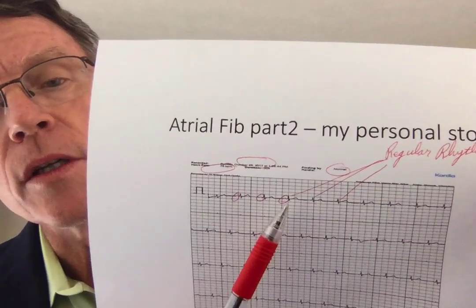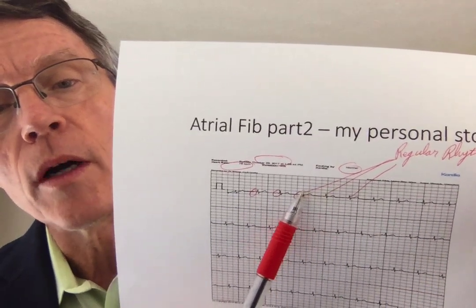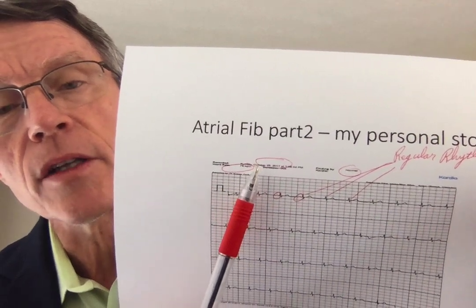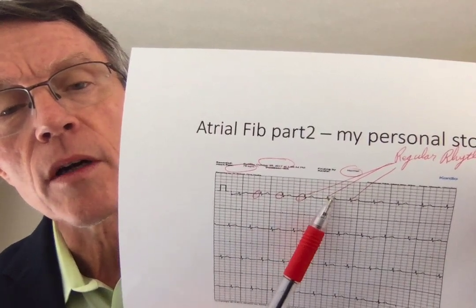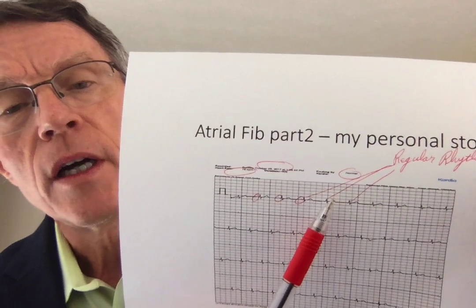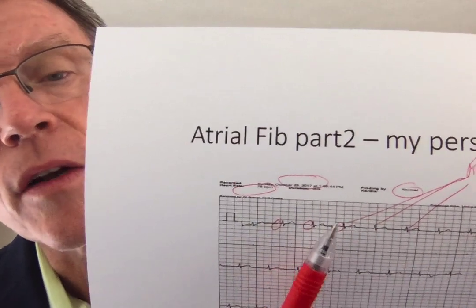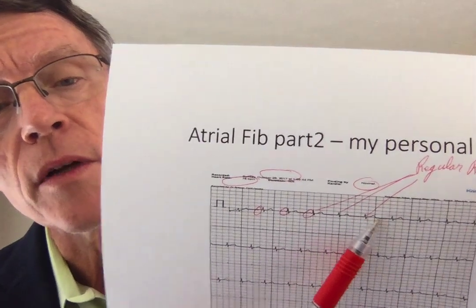So here you see the rhythm is normal. Boom, boom, boom, boom. The normal rates in between. Like I said, I usually have a rate down in the 60s. I'm standing and I've been doing some workouts, so I'm closer to the mid-70s right now. The other thing is, each one of these complexes, it's hard to see on this, and it's actually hard to see on the readout that I have. But each one of these complexes has a P complex, meaning you can see the organized impact of my atria.